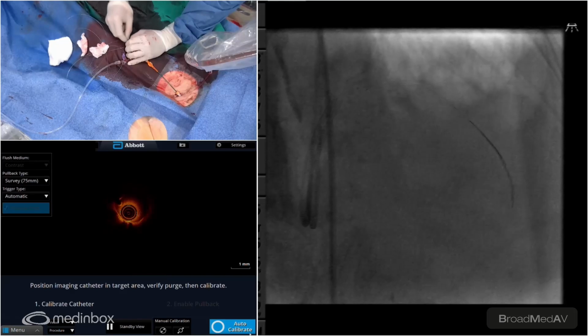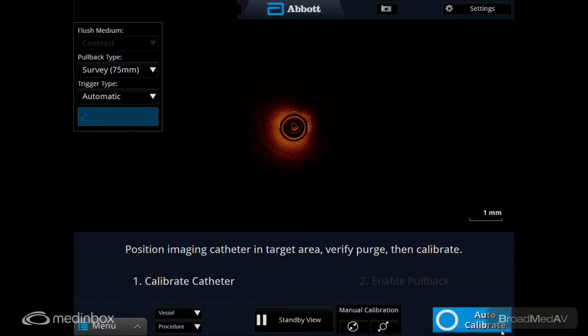Using the Rotaburr as a buddy system. Yeah, see, I think the angle is just not favorable for us. It's also, to be fair, been kinked a bit from our previous attempts. I'm trying to do a pull back on the wire. Oh, looking good. There. It's getting stuck there. It doesn't want to go any further. I think I want to see if I can gingerly get it across. There you go. Wonderful. Good technique. I think that's good enough.